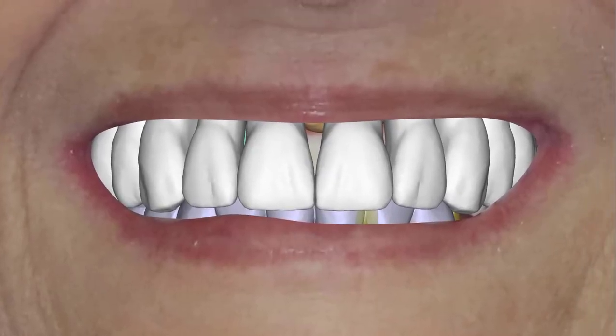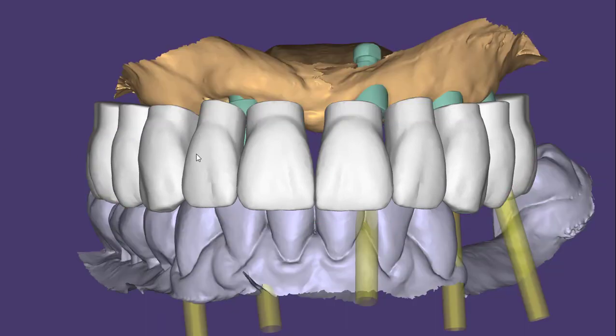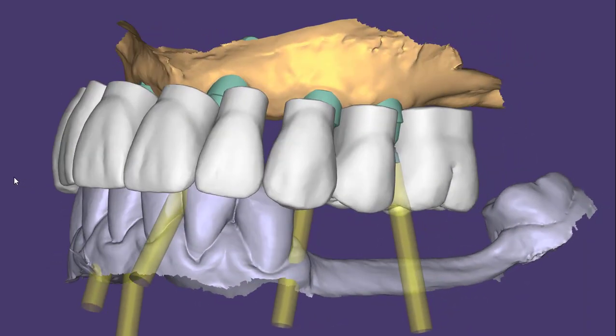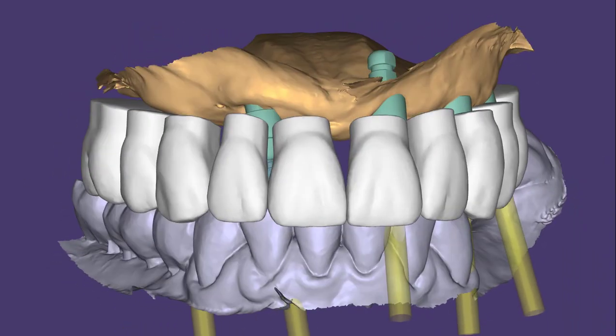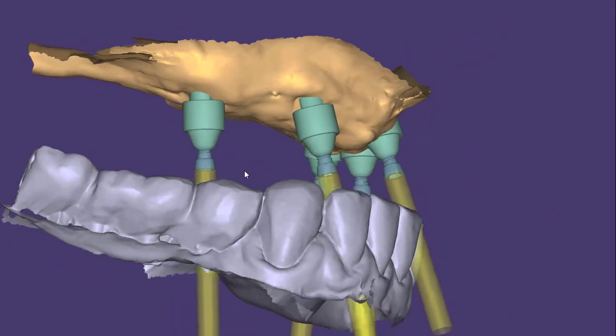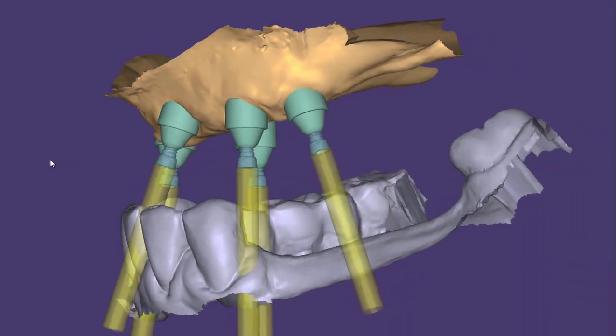I'll pull up another case example. This patient wants to go FP1 for the upper arch. I'll remove the visualization meshes. This is currently what she has — her midline is off and she's FP3. So we're going to move her to FP1. You can see the midline is corrected. You can see that wax-up getting the correct midline and the correct bite plane on both sides. The issue I'm seeing with this case is the multi-unit abutments are supra-crestal across the arch.